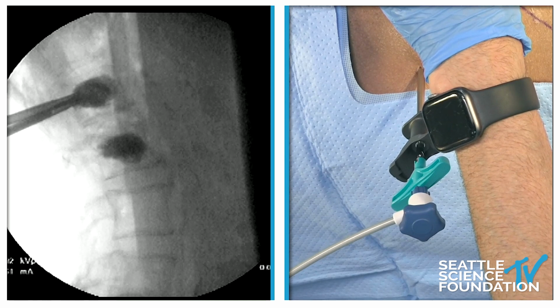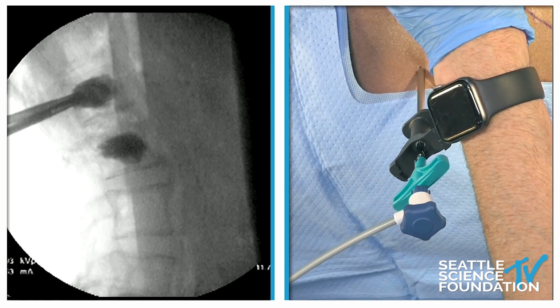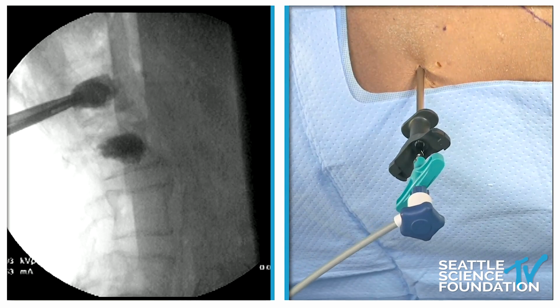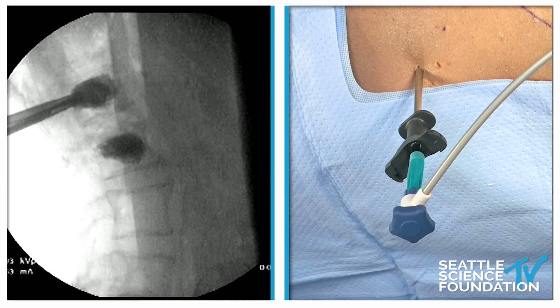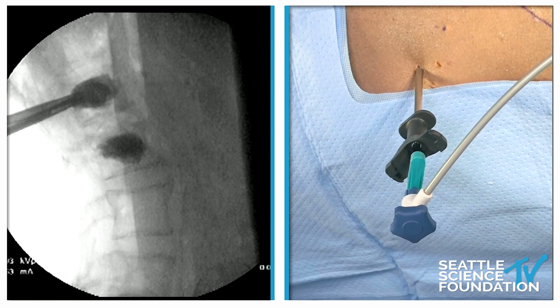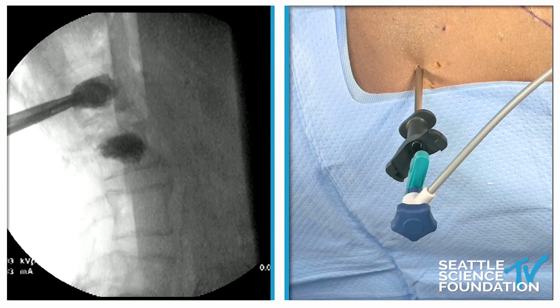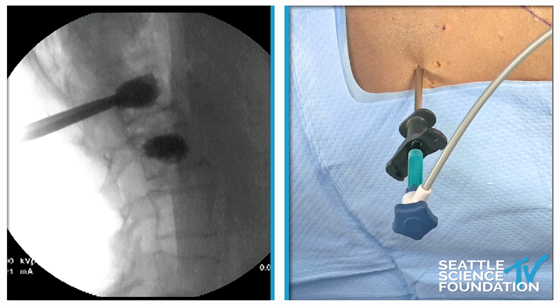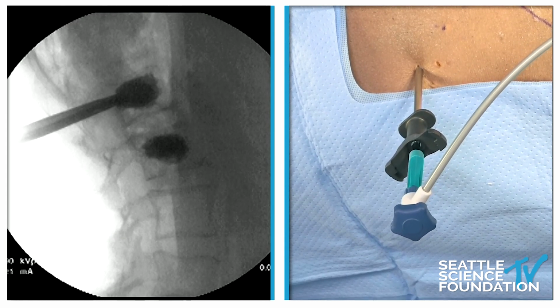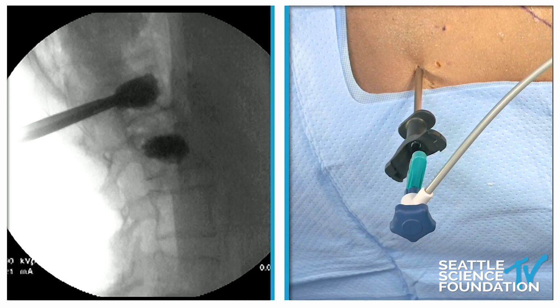All right. That's pretty good right there. And we always see how much cement we have proximally too. We can always see the amount of cement that comes here, the amount remaining. And we have about 3 cc's remaining. We've injected about 8 cc's roughly in here, which is a pretty good amount of cement. But that's enough to do the job.